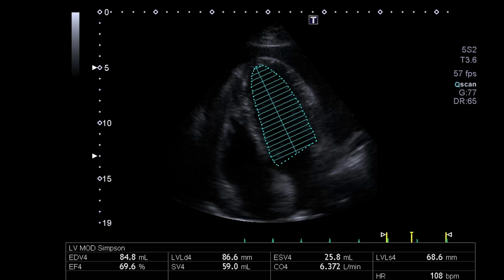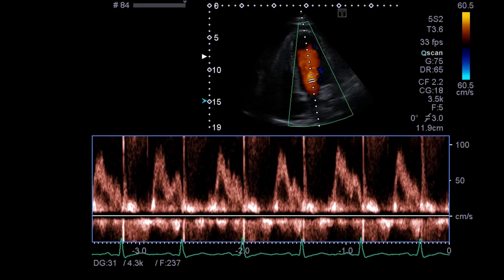What else do you do when you want to evaluate hemodynamic components in a case of a tamponade? Well, of course, the Doppler profiles. And here we see the Doppler profile over the mitral valve, the PW-Doppler. You can see small fluctuations in the peak values. This is what we need to pay attention to. However, I would say that there is not an awful lot here.